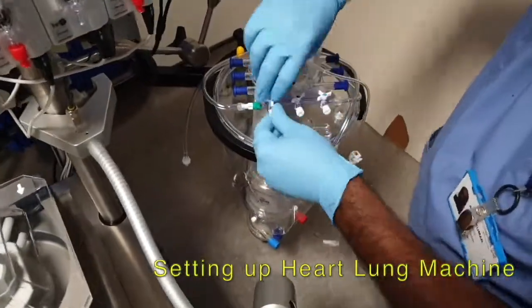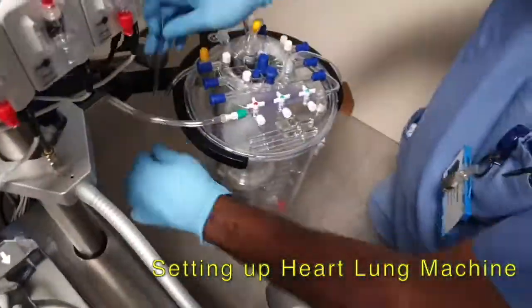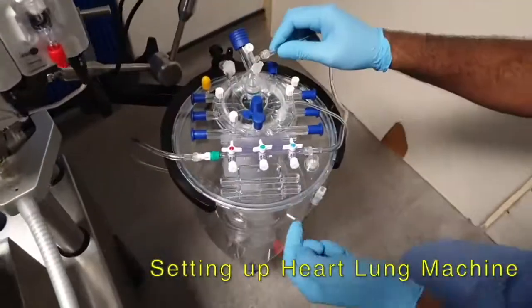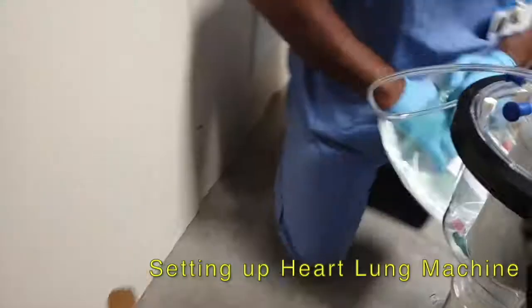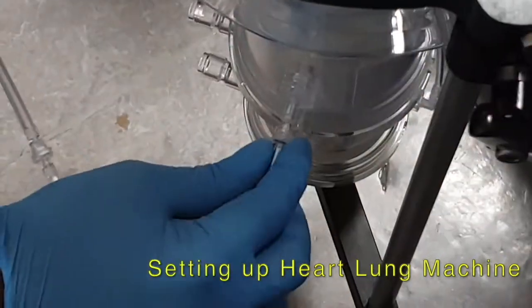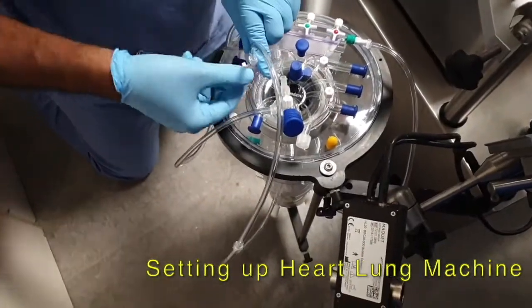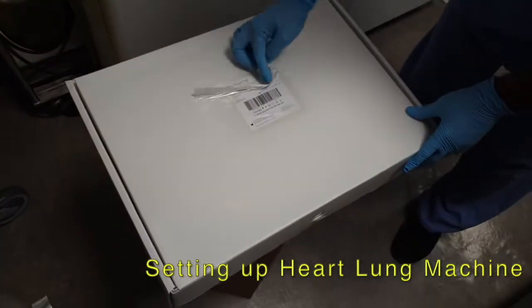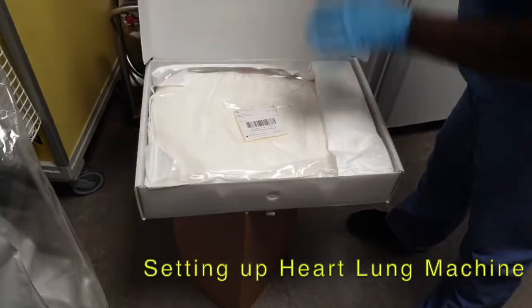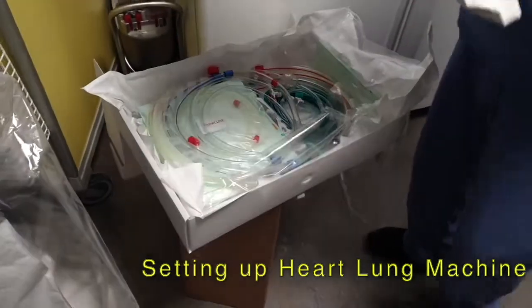There are a lot of little connections and joining of tubing to make up the complete heart-lung machine. These are the PVC plastic tubes which are used to transport blood from the patient into the heart-lung machine and back to the patient.